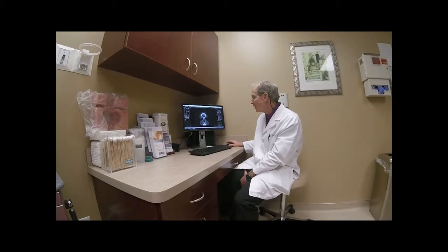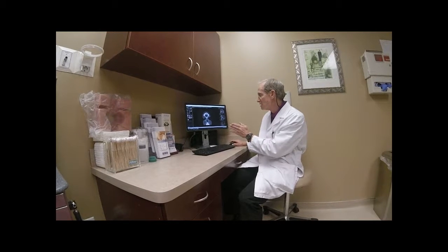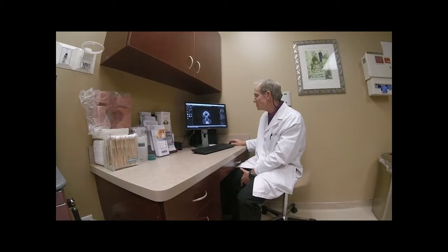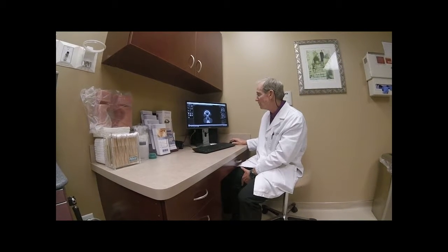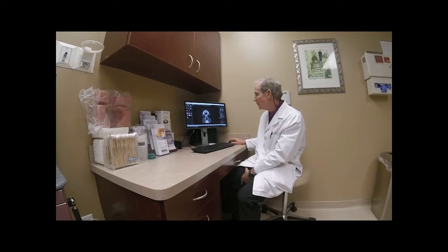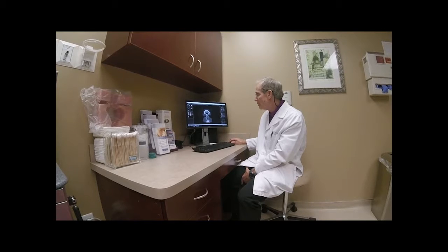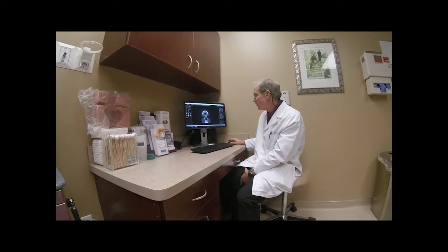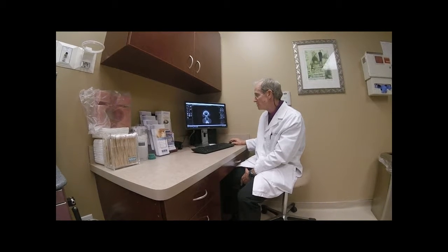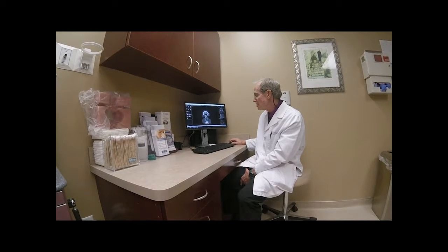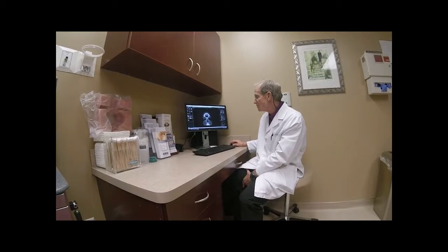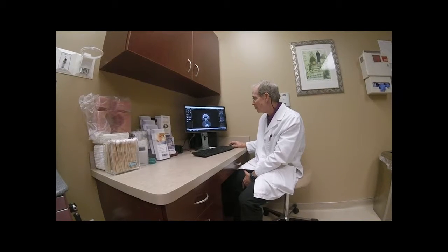I'm going to begin to scroll — what is happening is the x-ray machine has made multiple slices and we are picking up a slice a little bit behind the ones we started with. The frontal sinuses are filled with a very dark black space indicating they're full of air, and that's normal. If there is thickening or swelling of mucous membranes, a gray color will surround the perimeter of the sinus. The bone of the skull shows up in the white area, and we can begin to see the right and left eyes. On the sides of the nose internally are soft tissue structures called turbinates — a vascular spongy tissue that helps warm, filter, and humidify air. Sometimes they can swell and become obstructive to the airway, but they are very important to our physiology.